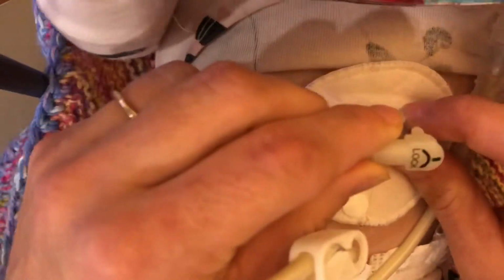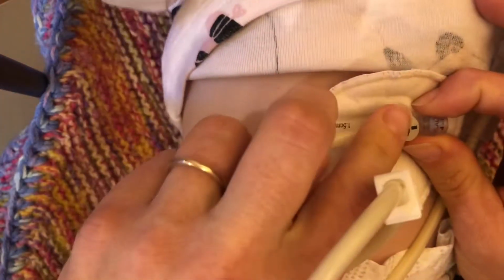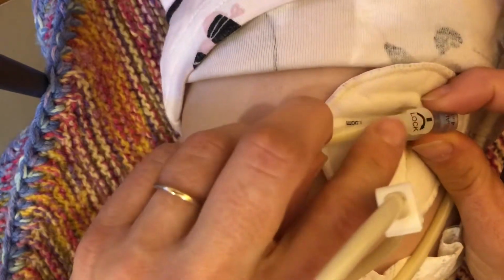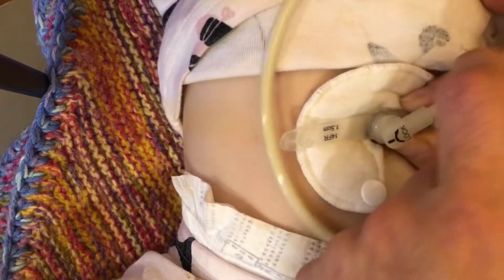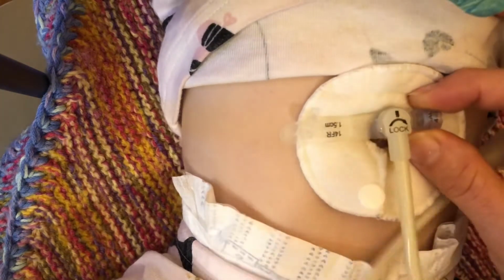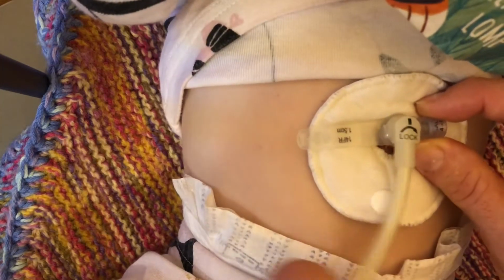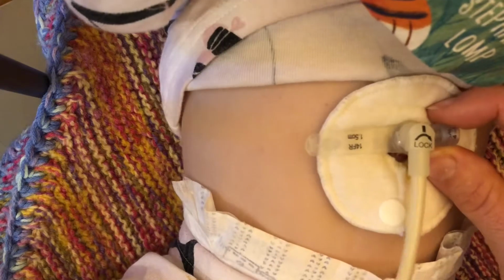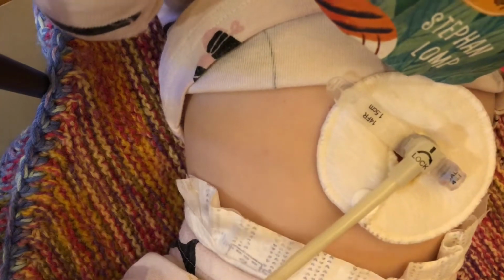So just to show you one more time, trying to keep the book out of the way. You just push it in there, and I hold it steady with my other hand, and then you just turn it in the direction. I turn the actual tube like that and hold it steady so that it's locked into place, and then it won't turn anymore after you do that turn. See, it won't go any further. And then it's connected.